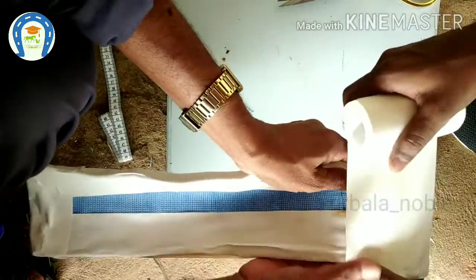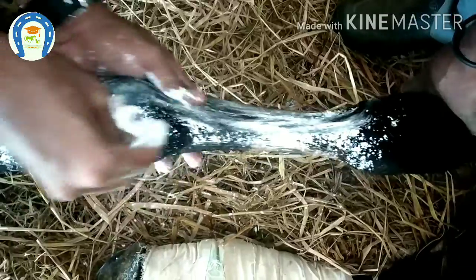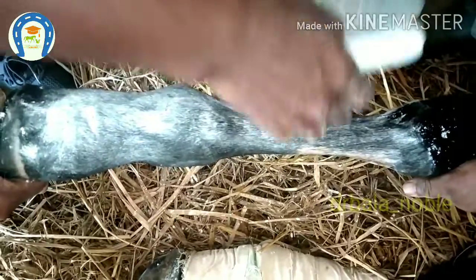Okay, now the splint is ready and we will apply it. This is boric acid, basically an antiseptic. It will produce heat so the moisture will be lost and the legs become dry.